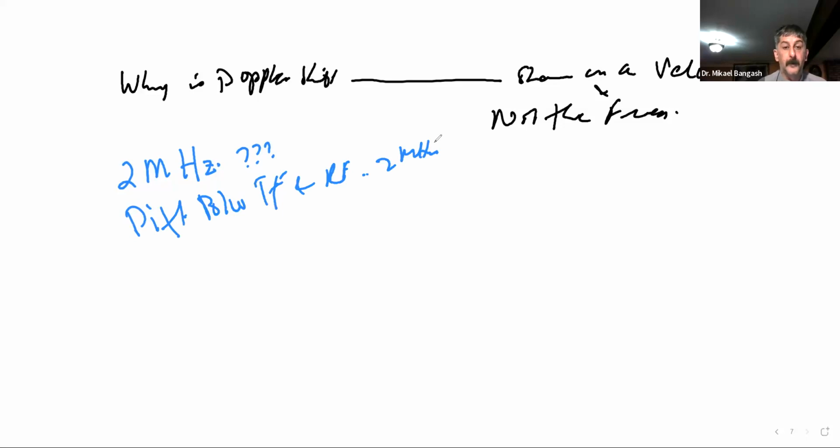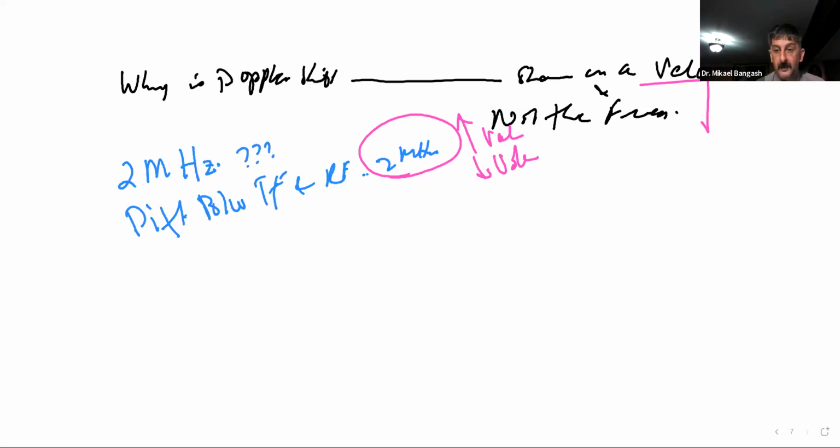But you don't know whether this means a high velocity or a low velocity. So that is mainly why your system will show your Doppler shifts as a velocity, in any unit of distance by unit of time.